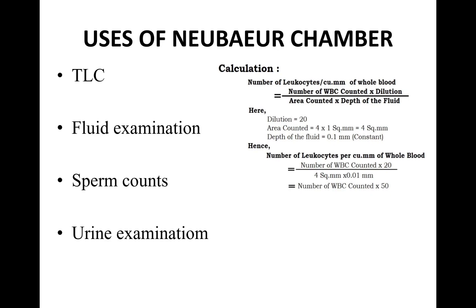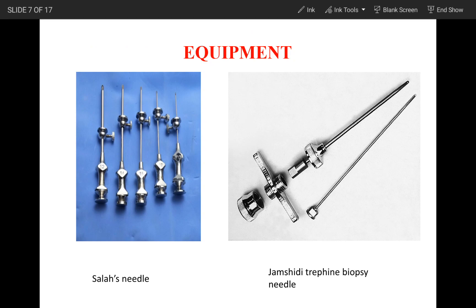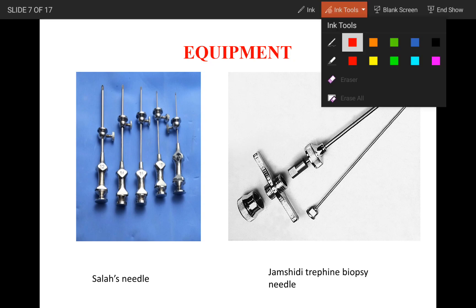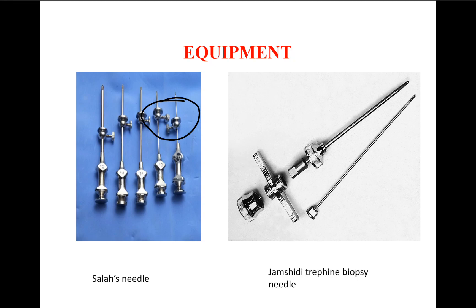Next are your bone marrow aspiration needles — these will definitely be kept in your spotters. This is your Salah's needle. You can see the guard with the edge, and this is your biopsy component. On bone marrow, you can either do aspiration — which gives a bloody smear with particles of bone marrow — or biopsy.